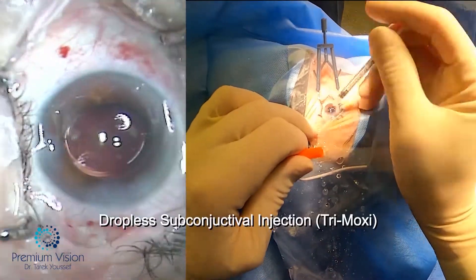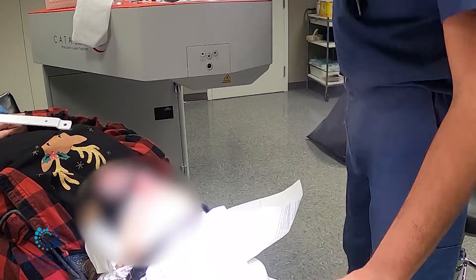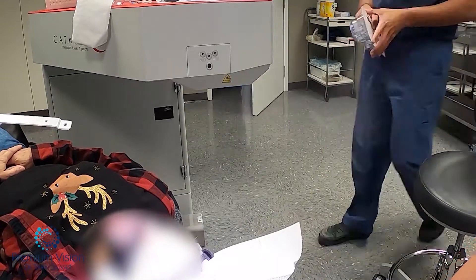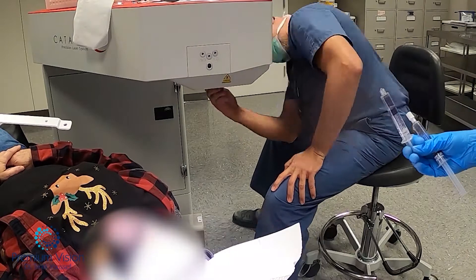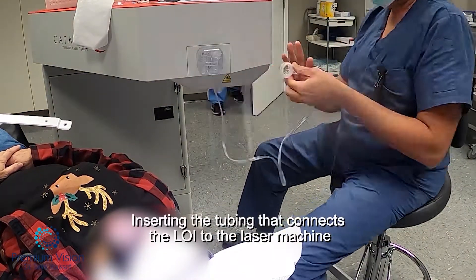The injection is done and this eye is done. This was the left, easier eye. Now we're going to the right, more difficult eye, which is a hypermature intumescent cataract. The cataract is swollen — I'm worried about it exploding during the procedure — so the laser comes in very handy here because it does the capsule access in a second.